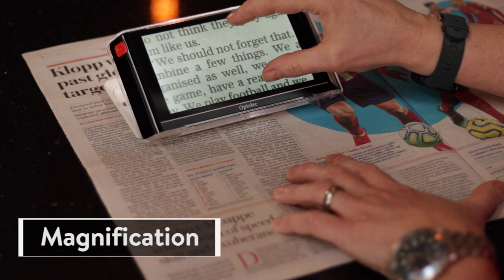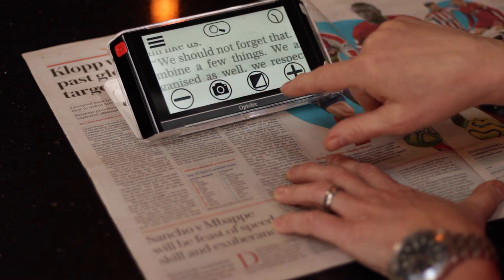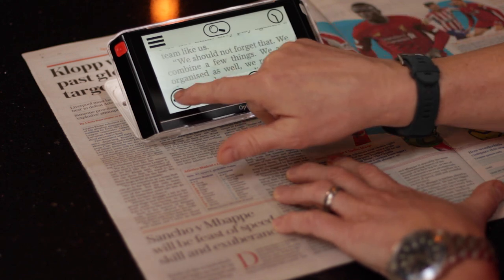So I've got my morning paper, I've got my reader, and it's on the font size that I want to read. I can manipulate that now. There are no buttons on here — it's all touchscreen. You can adjust it in any way you shape or form. At the moment we're in live mode, which shows you the picture as it is represented on the page.